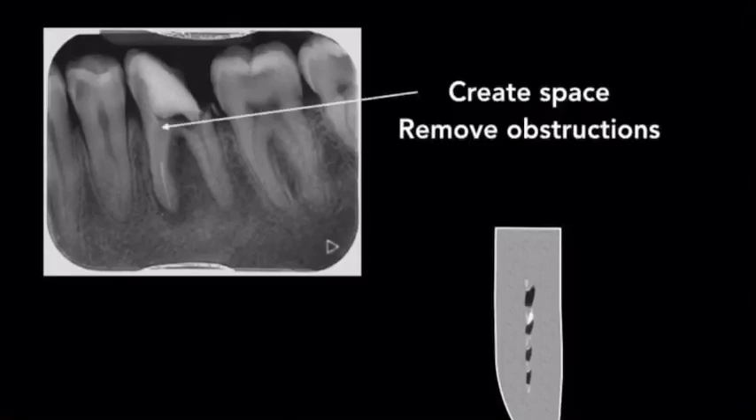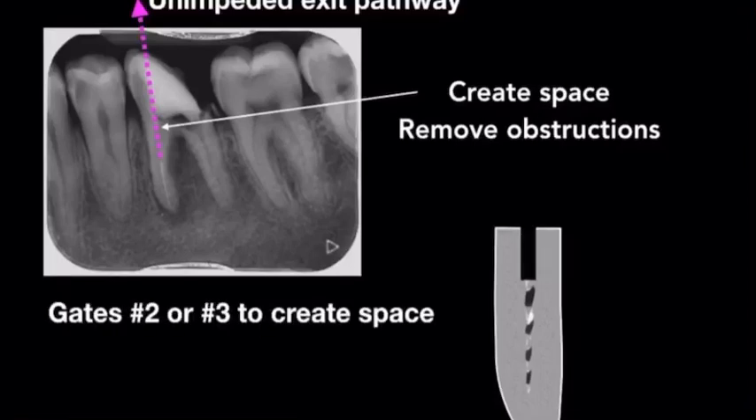In order to retrieve a separated instrument such as this, we need to make sure there's an unimpeded exit pathway and remove any obstructions. This is best carried out with a modified Gates Glidden size 2 or 3. We want to be conservative so as to not destroy the root canal.